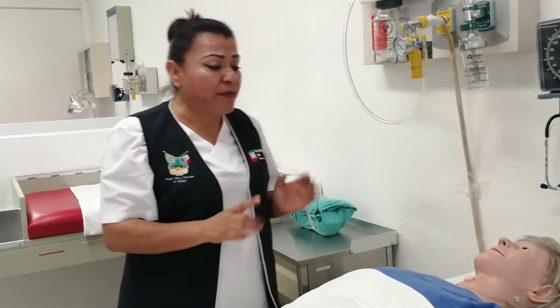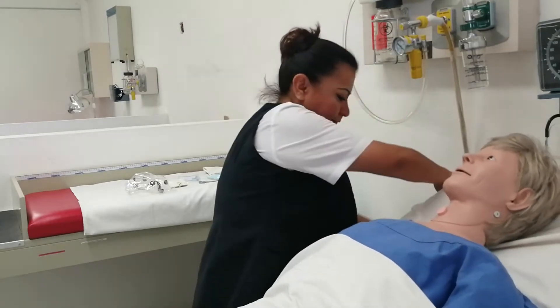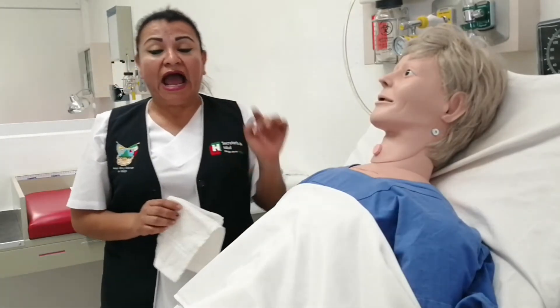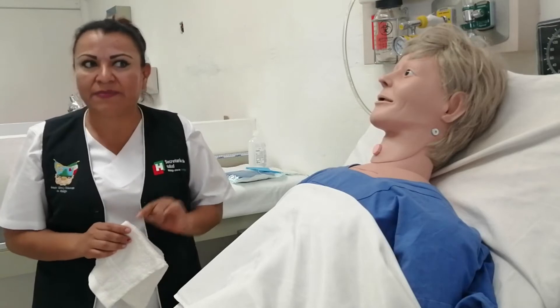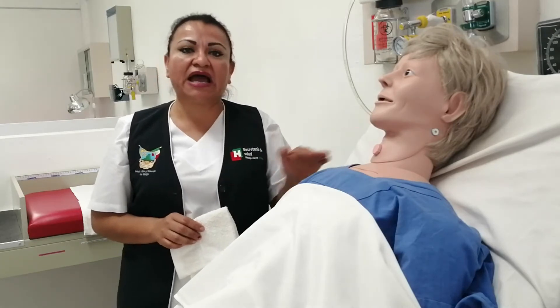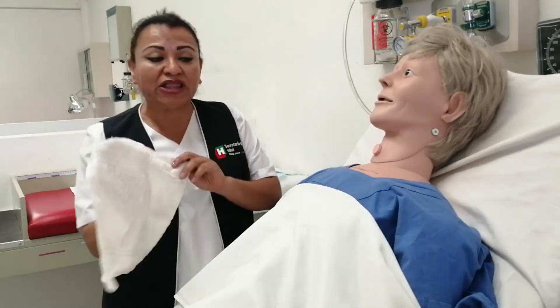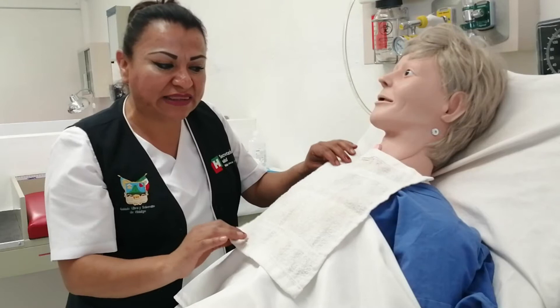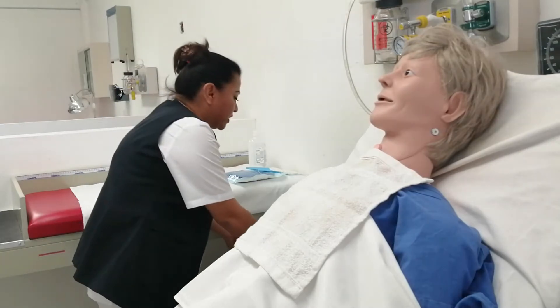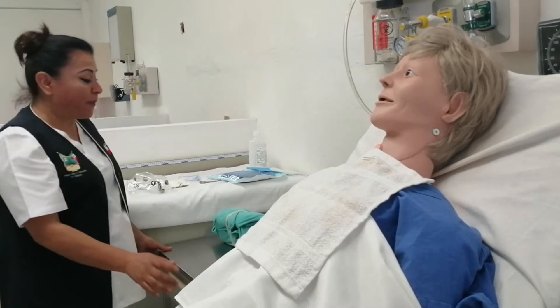Procedo a poner en posición semifowler al paciente. Es muy importante verificar que no haya ninguna contraindicación; si la hubiese, se le aspira en posición de cúbito dorsal. Después colocamos una toallita sobre el tórax del paciente y procedemos a preparar el material y equipo para su uso.